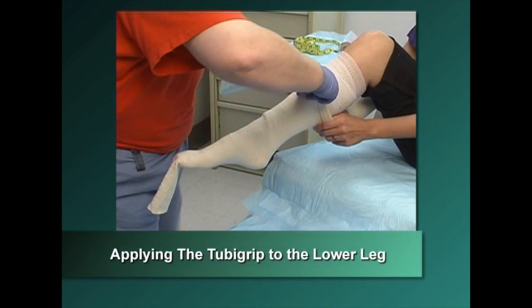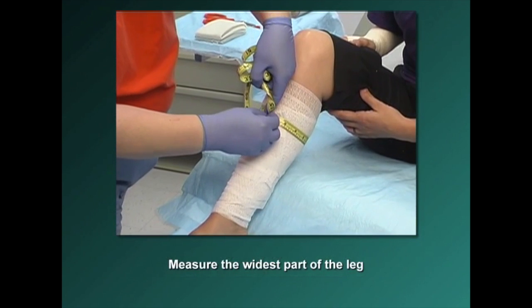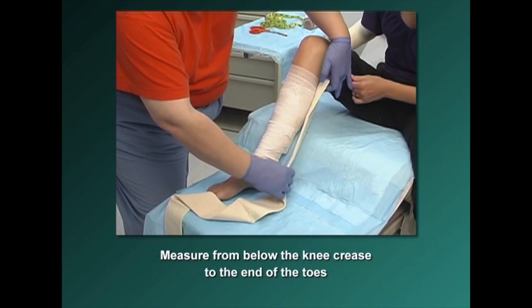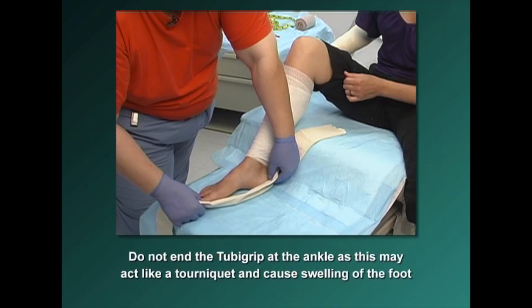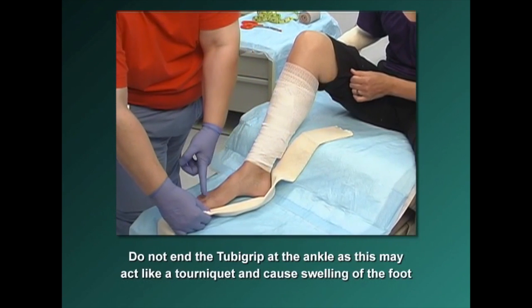To apply Tuba Grip to the lower leg, measure the widest part of the leg — usually around the heel or the widest part of the calf. By measuring the widest part of the limb, you can ensure the appropriate size Tuba Grip is applied so it is neither too tight nor too loose. Measure the length of the leg from below the knee crease to the end of the toes to determine the length to cut. Do not end the Tuba Grip at the ankle, as this may act like a tourniquet and cause swelling of the foot. To end the Tuba Grip at the toes, cut it at that point.